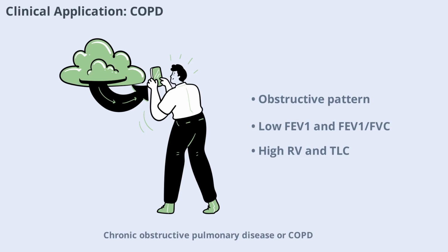Chronic obstructive pulmonary disease, or COPD, is another obstructive lung disease. It's characterized by persistent airflow limitation, with a reduced FEV1, low FEV1-FVC ratio, and often increased residual volume and total lung capacity due to air trapping.